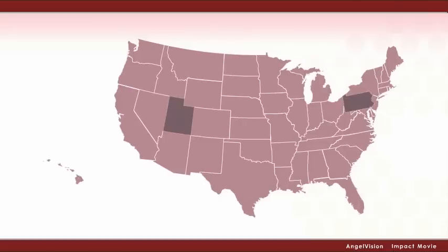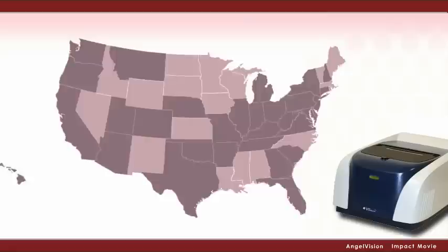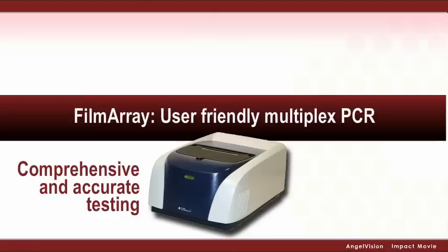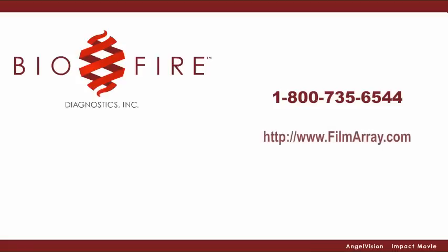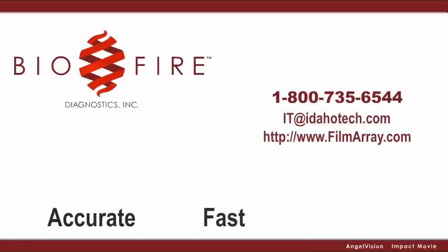And because it's the easiest molecular test on the market, it's no wonder hospitals across the nation already rely on it. To provide comprehensive and accurate testing using an easy, cost-effective method, rely on the Film Array, user-friendly multiplex PCR. Contact us today to get started. Request a free demo to learn first-hand how easy it is to use the Film Array.